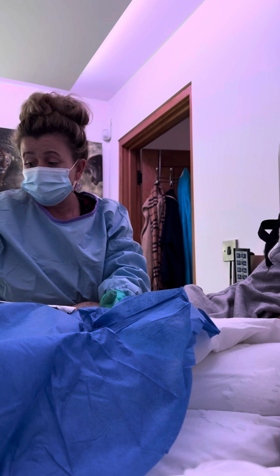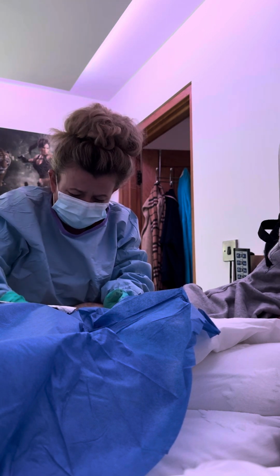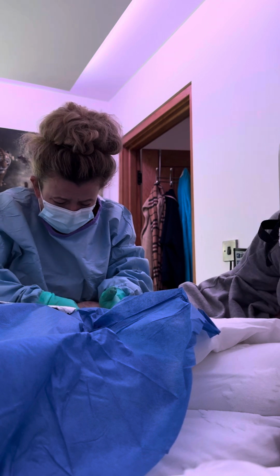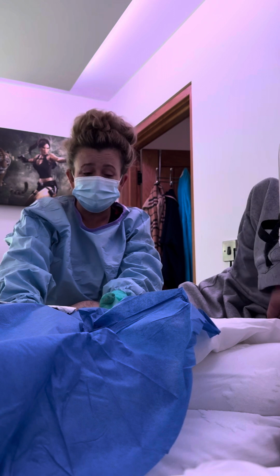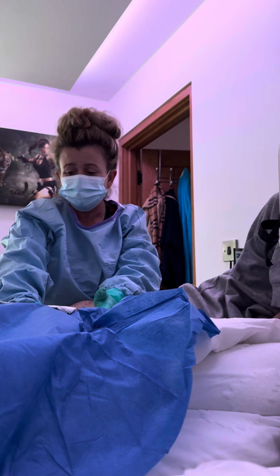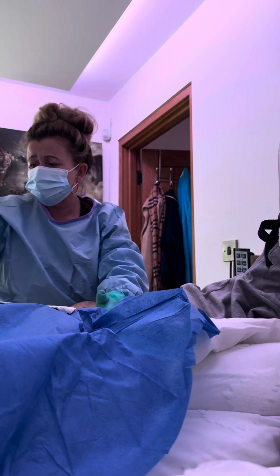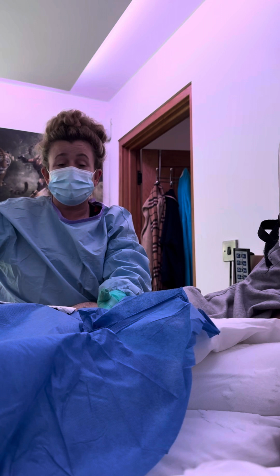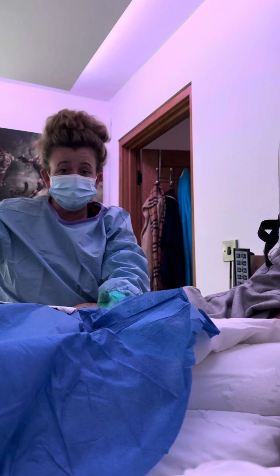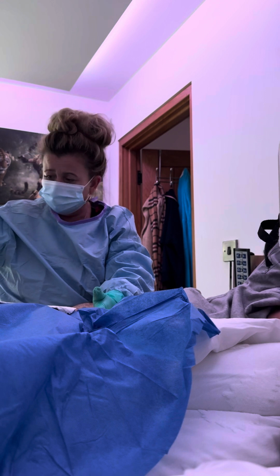So I've got no blood, no nothing. I just need to clean the area up where, obviously, what happened is I got urine coming out of the stoma as well as the penis. So it's kind of like I've got to fault find as much as possible. If this catheter doesn't work today, then I'm going to take it out, put a new one in, and call the hospital and ask them for help, because that is it with me.